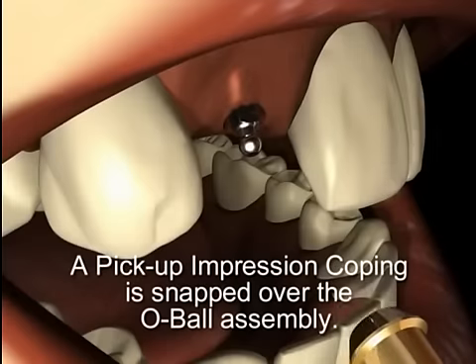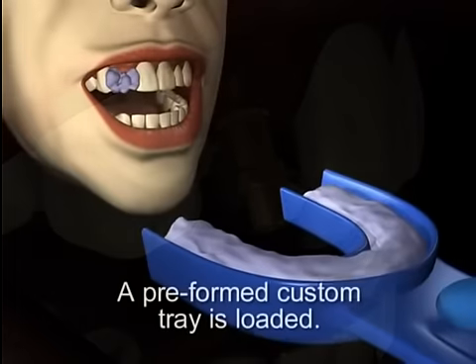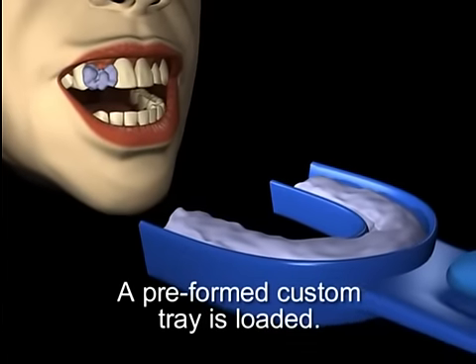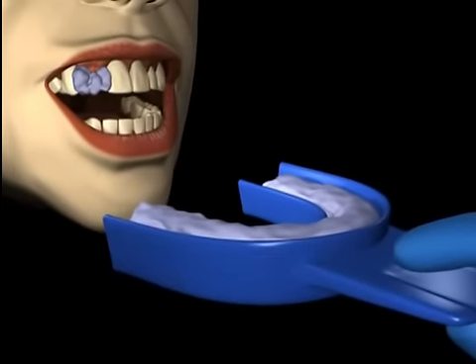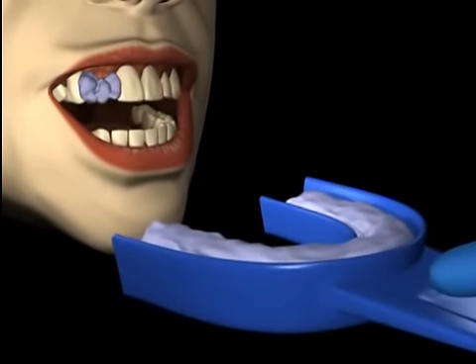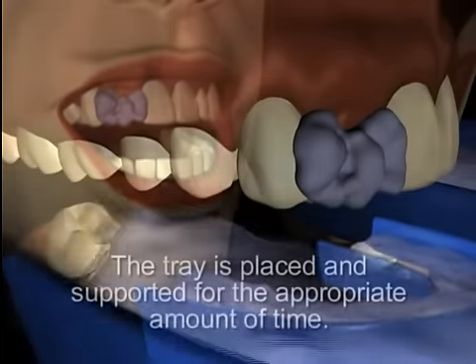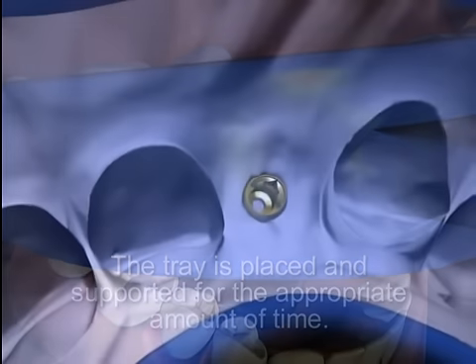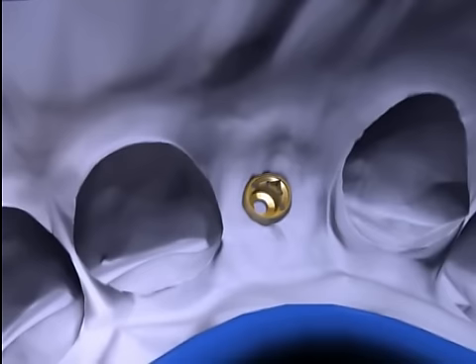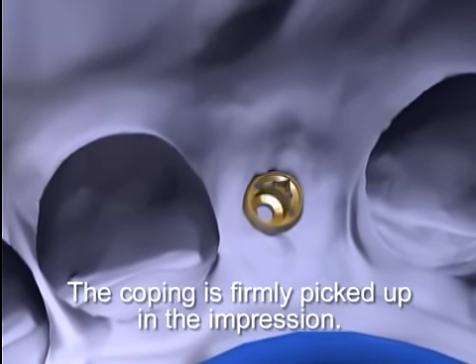A MILO pickup impression coping is snapped over the O-ball implant assembly. A preformed custom tray is loaded while syringe material is expressed over the pickup coping and adjacent teeth. A monophase impression material is appropriate for this procedure. The tray is placed and supported for the appropriate amount of time. The final impression is removed and inspected. Examination reveals that the coping has been firmly picked up in the impression.